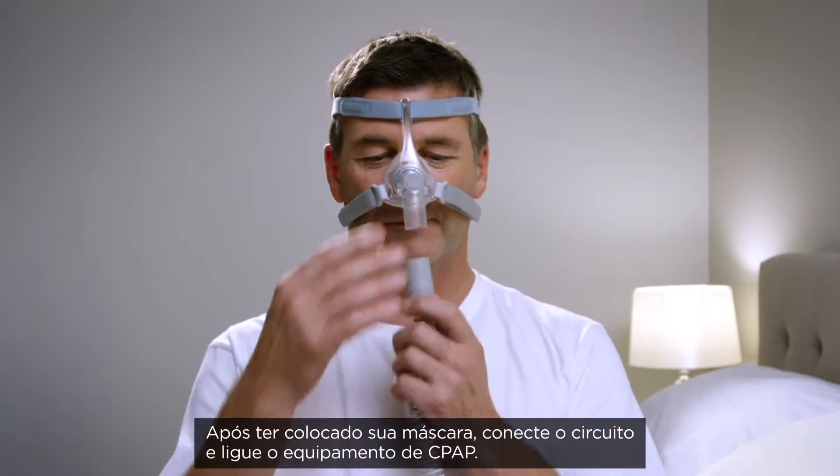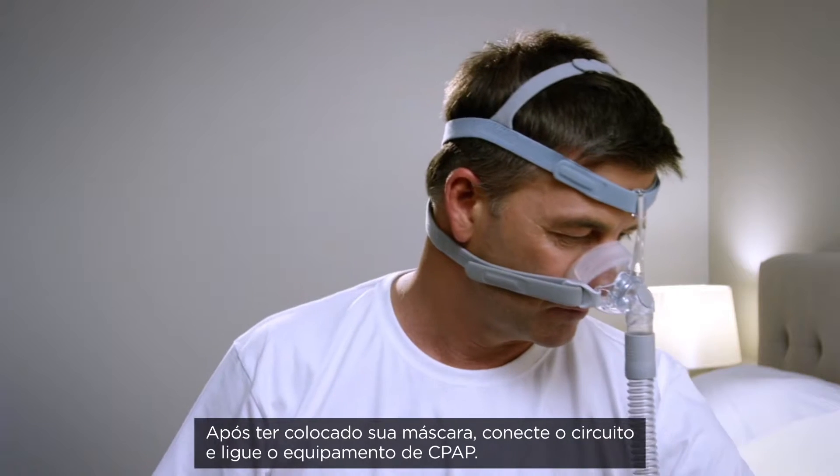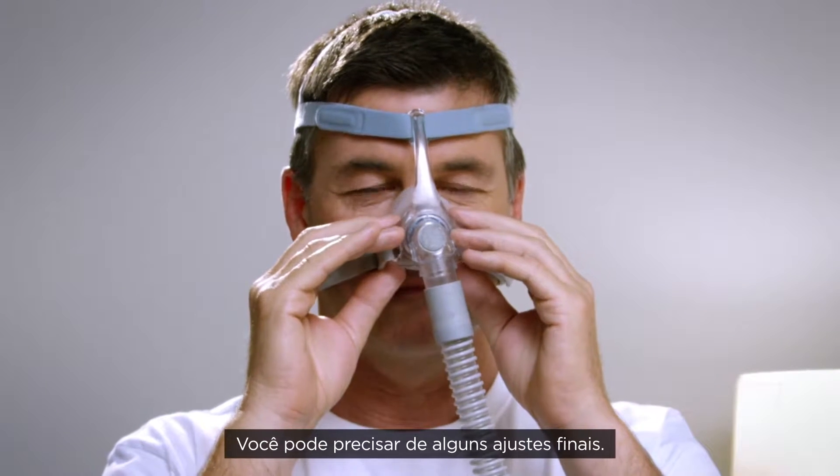After fitting your mask, attach the tubing to your mask and turn your CPAP device on. You may need to make some final adjustments.